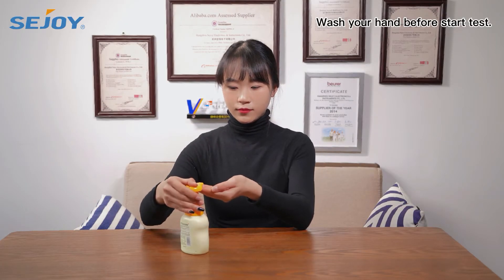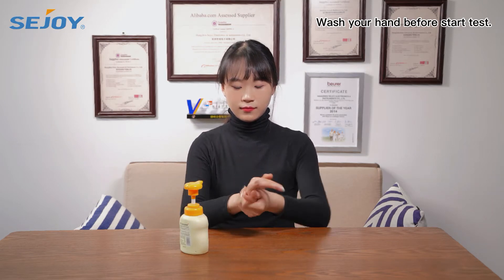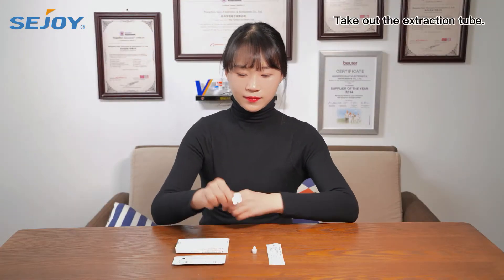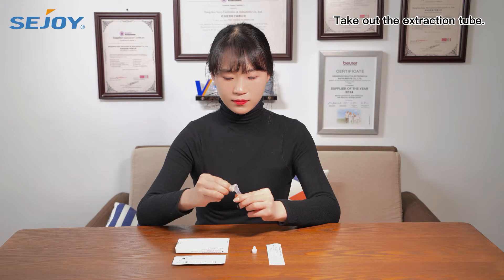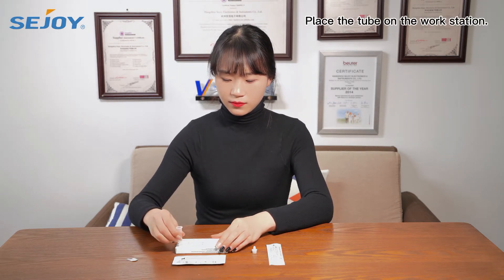Wash your hands before starting the test. Take out the extraction tube and place the tube on the workstation.